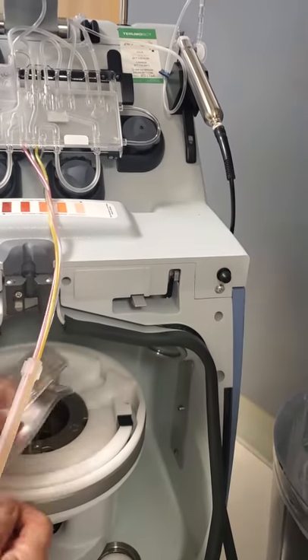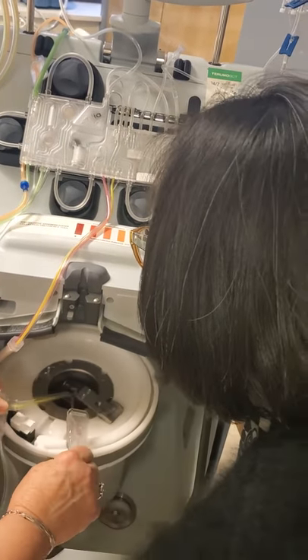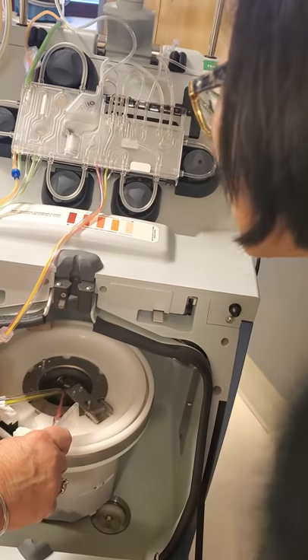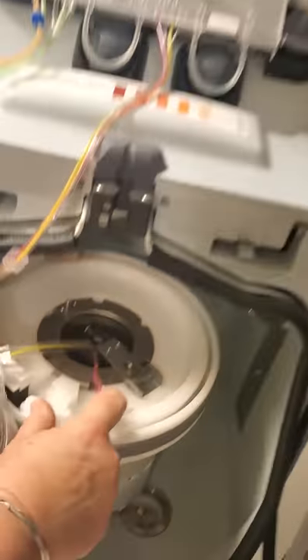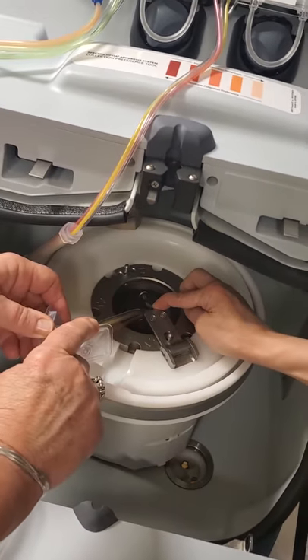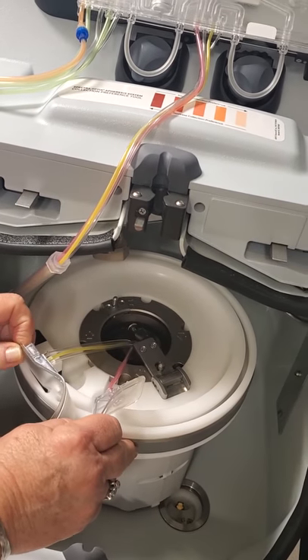Bring them over here where they're going to belong eventually, because that will help a little. The red tube is going to be over here and the yellow over here — you need to line them up where they're going to end up. The red inlet line goes right in this groove, the connector goes left, and when you make them kiss faces and pull them straight back, you see that it's perfectly loaded.